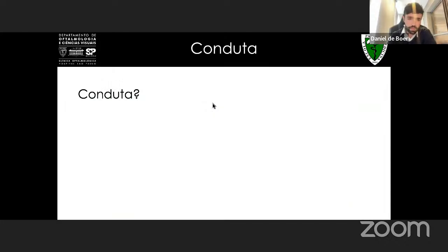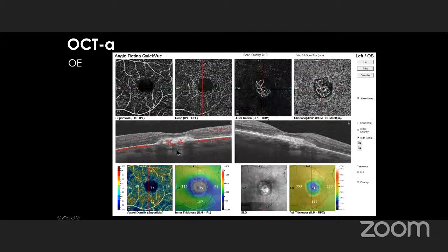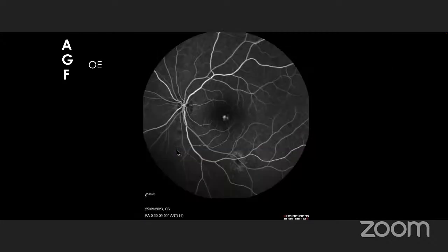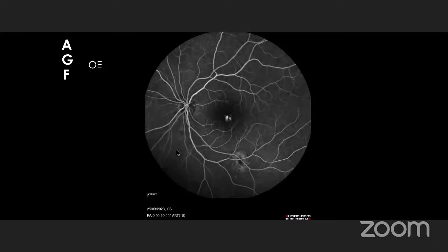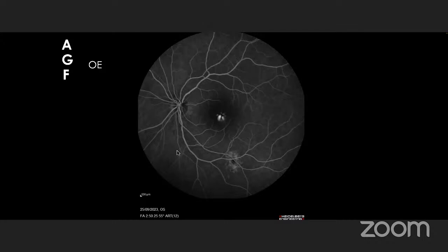Então, gostaria de abrir para as condutas. Então, na angiografia, acho que tem um padrão de edema cistoide na mácula, né? Você não consegue ver vazamento, tipo uma membrana clássica, ou não. Só pegou, tipo, o edema cistoide, né? No OCT você consegue ver a trama melhor, né?